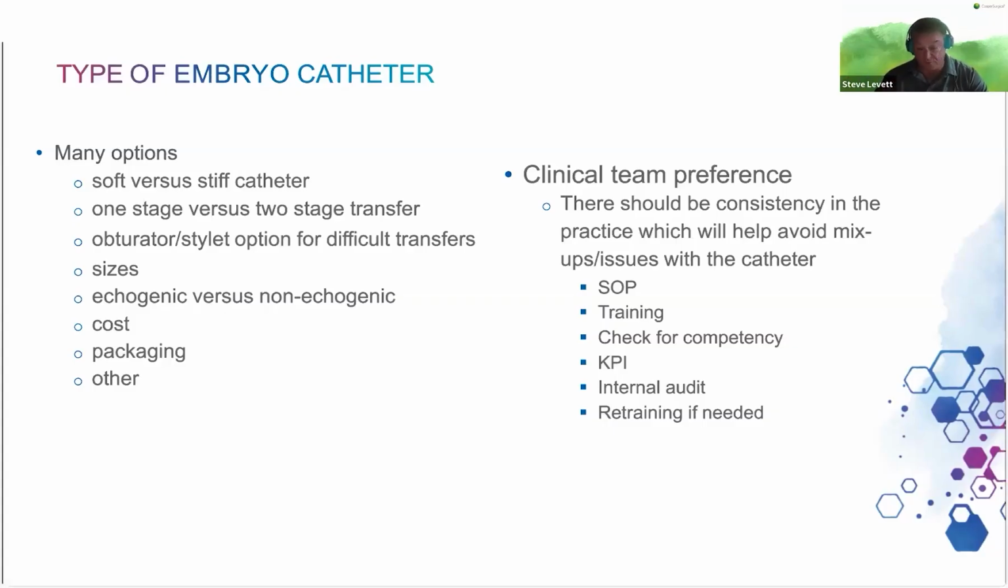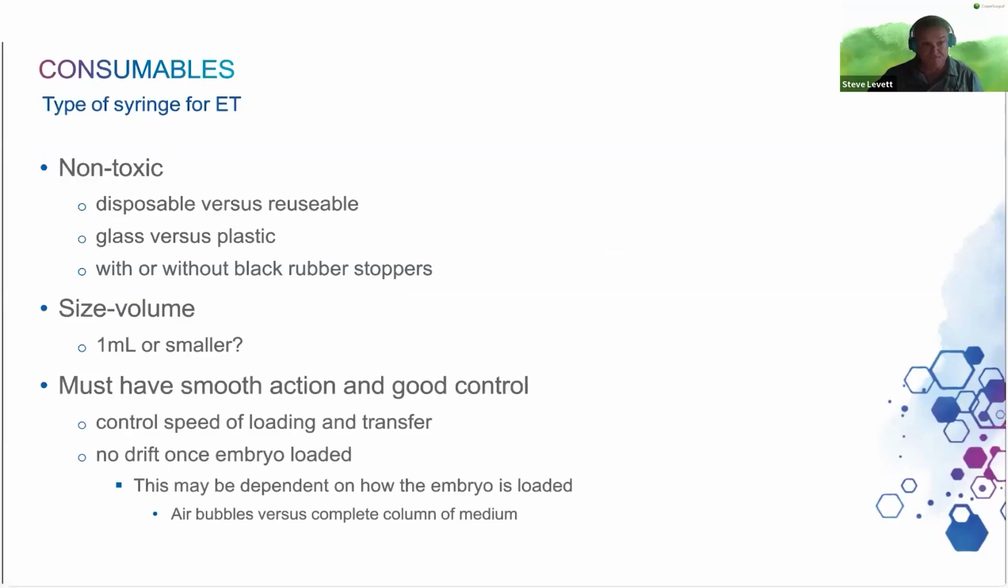It makes it much easier to track what's happening, to follow individual performance, so monitoring your KPIs, etc. Much easier if everybody uses the same catheter rather than everybody just choosing one that they've learnt on or have a preference for. All catheters can give you good results if they're used correctly. Some have advantages over others, but in any clinic, ideally, everybody uses the same catheter.